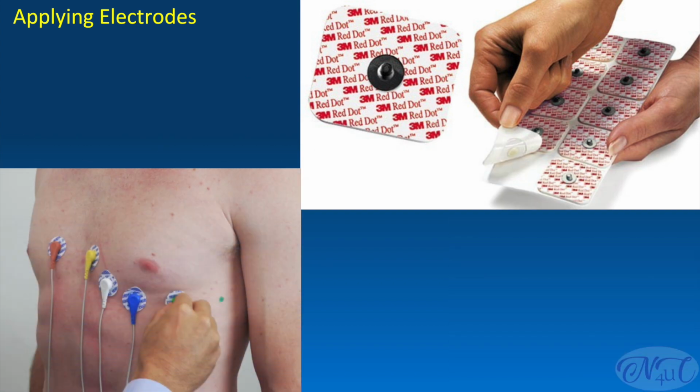Gently abrading the skin with a clean, dry gauze pad helps to expose the inner conductive layer of epidermis, which will reduce skin impedance. Although cleansing the skin with alcohol removes any oily residue from the skin, it also increases the skin's electrical impedance and hinders detection of the cardiac electrical signal.